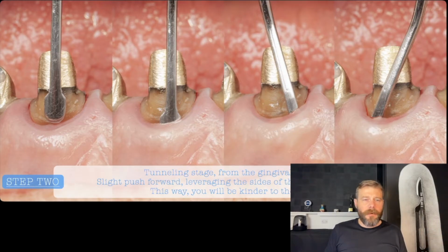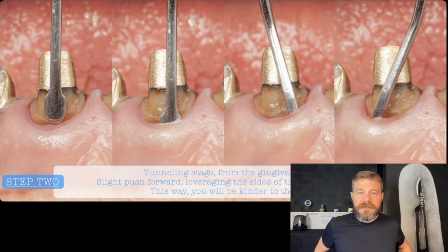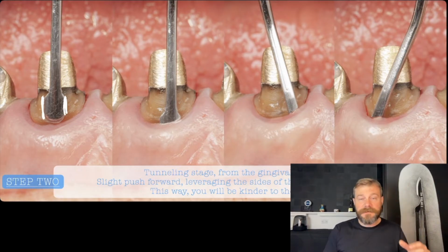Okay. What else do you have here? Well, that was the regular tunneling instrument. I already showed that on the macro view here, a little larger, and there are some insights about this instrument. First, you see that this instrument is a little bit larger on the sides. Why is this instrument a little bit larger on the sides? But first, how to use a tunneling instrument in a very delicate phenotype.